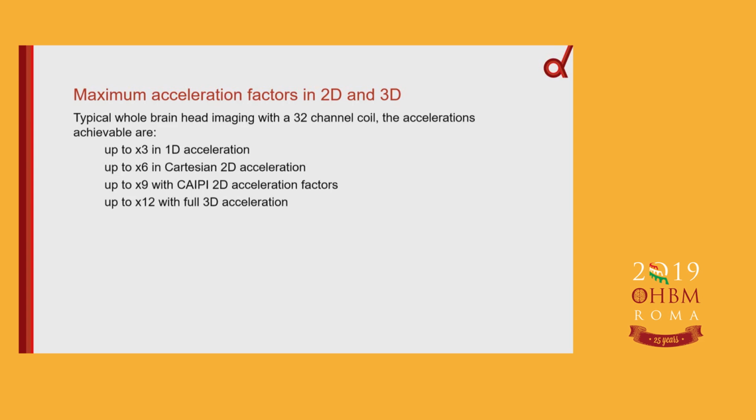And we're lucky, I think, in terms of doing brain imaging, and am I allowed to say Nova Medical? The 32-channel coil is more or less the standard which everybody is using, right? So if you're looking at Wittig's slides about how many people are doing RF coils, actually a lot of the time, almost everybody's using the same stuff, right? So we can compare a lot of these protocols with each other. I think ultimately, when you put everything together, you shouldn't probably be aiming for an acceleration factor much above 12 in total when you're doing 3D.